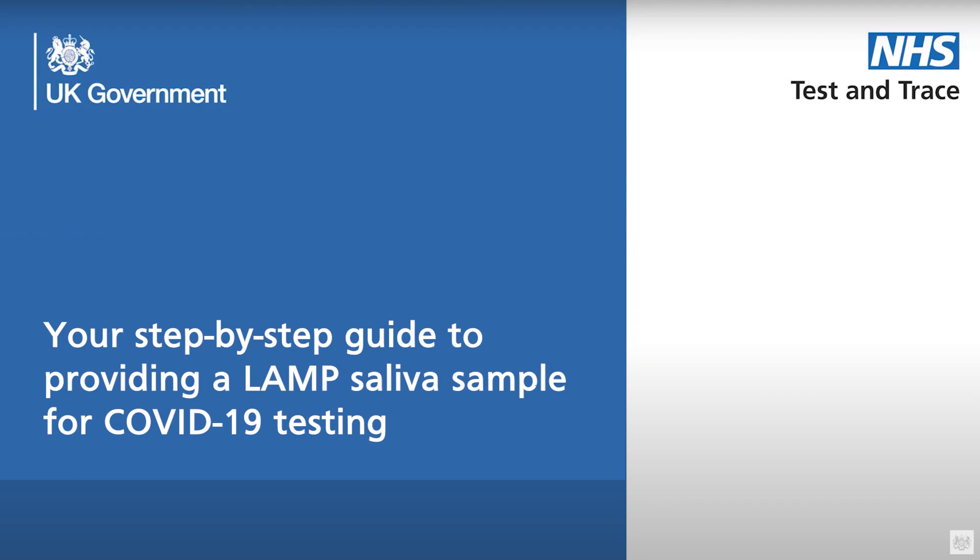In this video we will show you how to take a saliva sample for COVID-19 testing. It will explain how to test yourself or another person for COVID-19 using the saliva sample collection kit. It tells you how to take your sample, how to safely package your sample for transportation to the laboratory, and how you will receive your results.